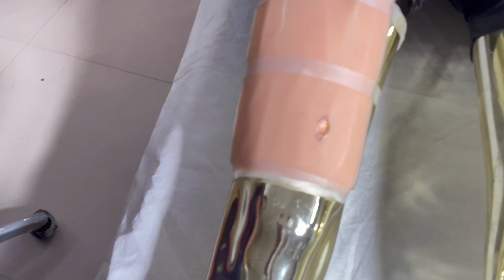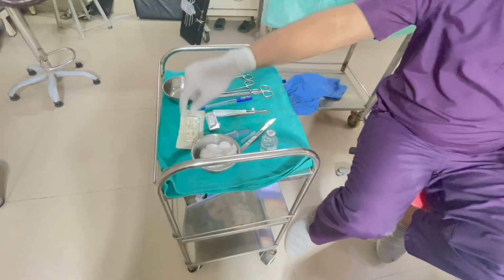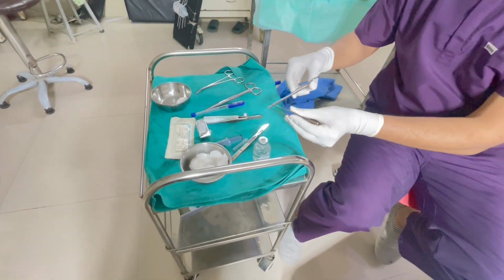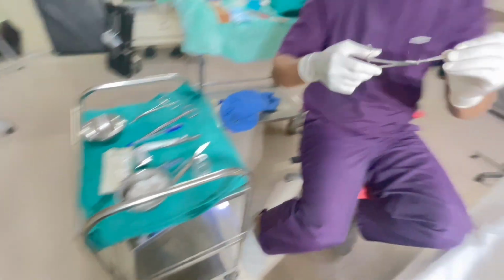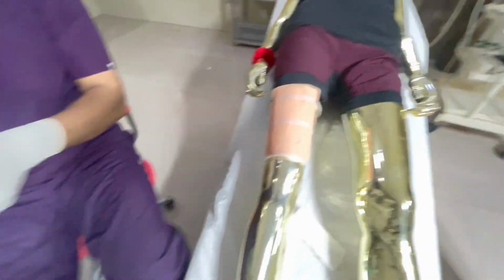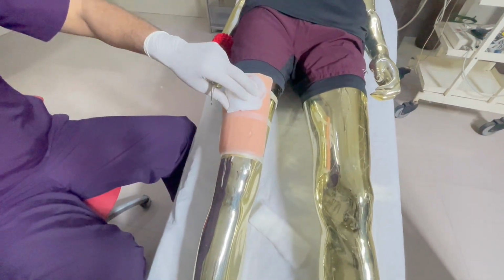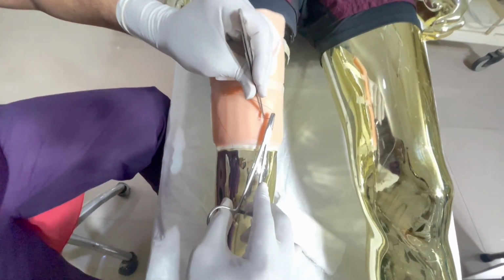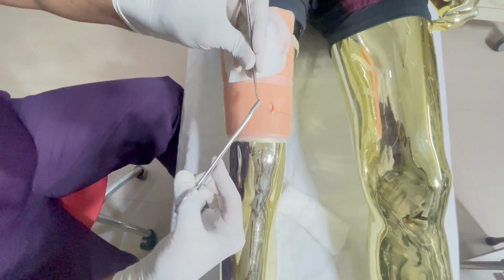So this is the specimen that will be put in for the histopathology. Then I will check the expiry of the suture material. If there are pads or cleaning drapes, I will put them on and press, to see that there is no bleeding. Then I will take a few stitches in this manner.